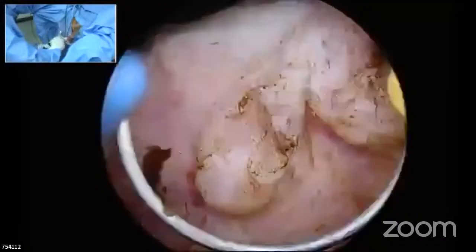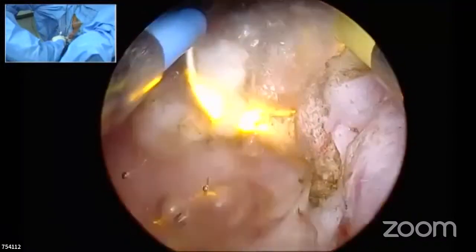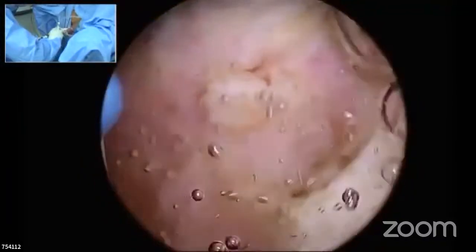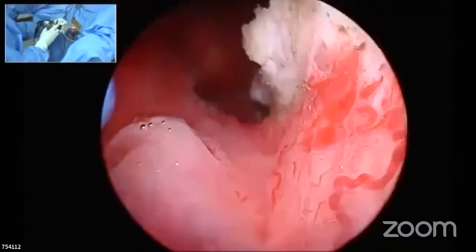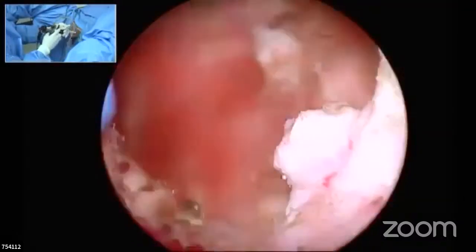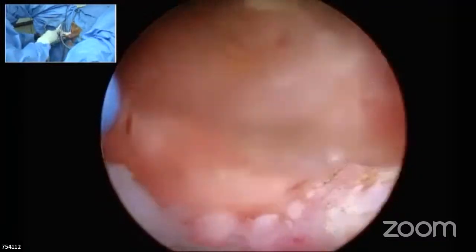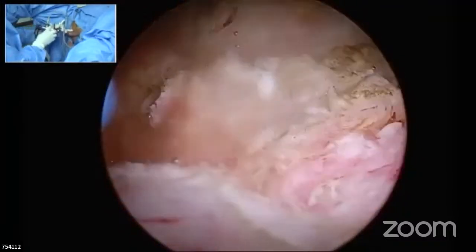I've reached the capsule at the majority of the points near the bladder neck and midway between the bladder neck and the prostatic capsule. But now looking at this point, this is the veru and this is the apex. And you see that there is some amount of tissue which is there. I need somebody to observe. This is the apical tissue.